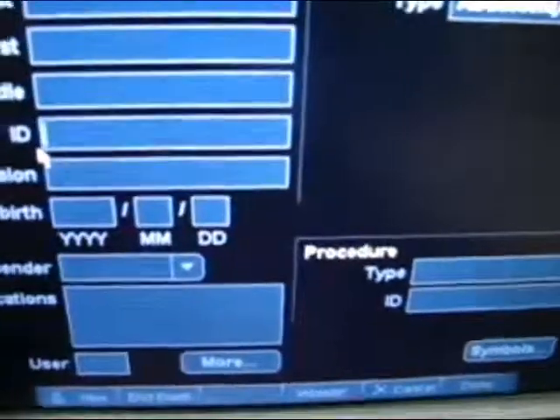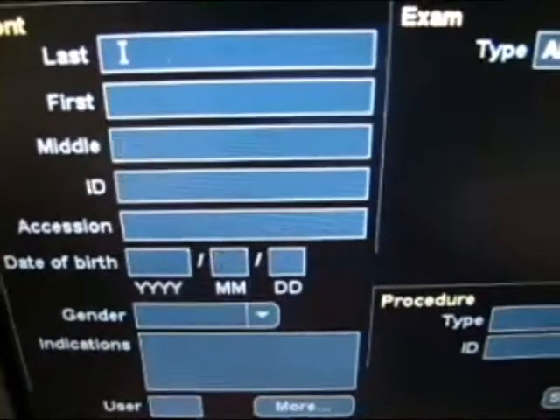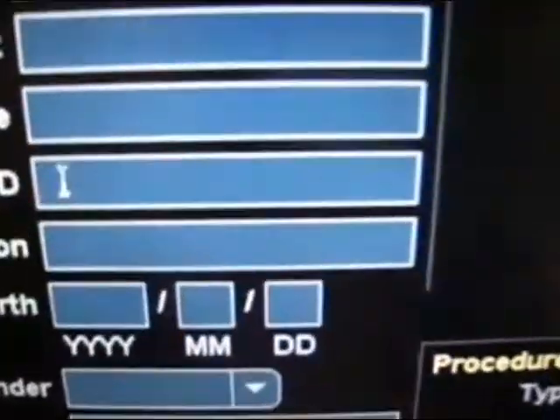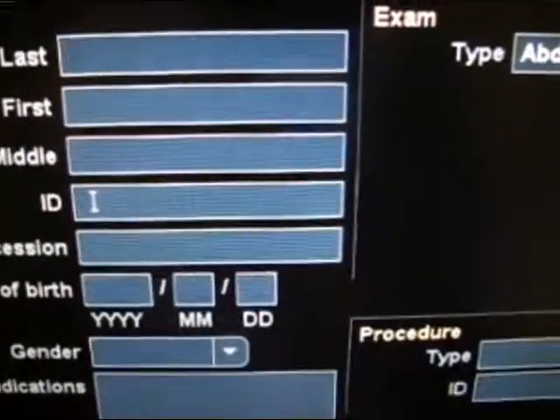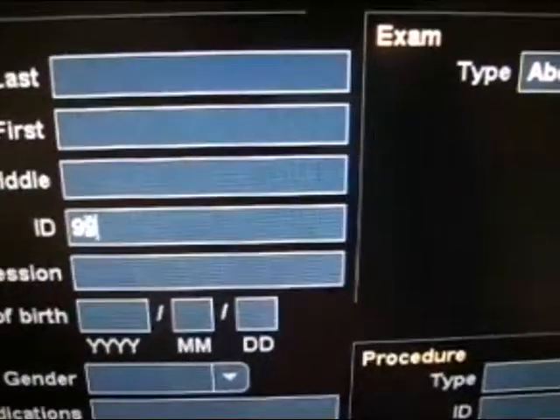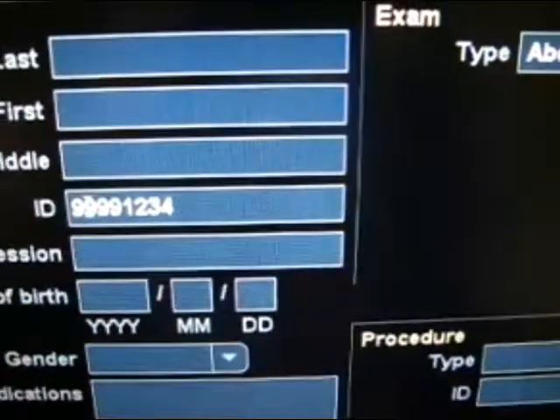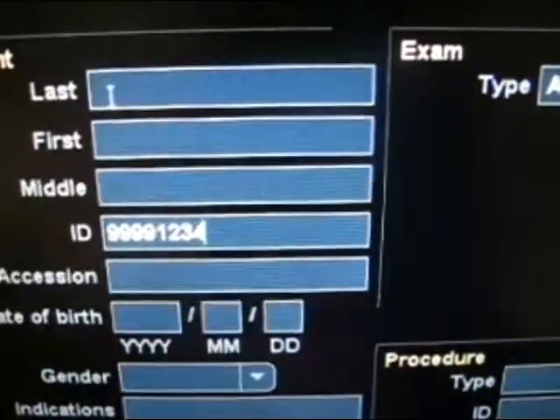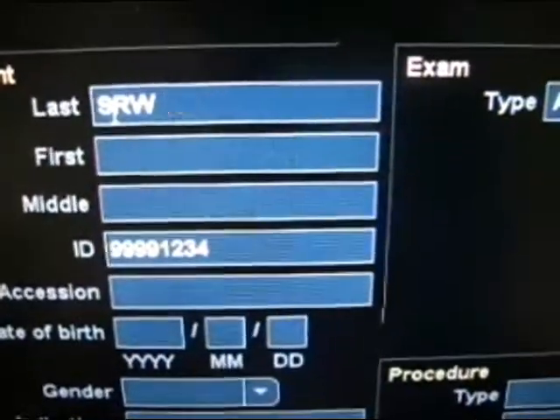Please remember to place your three-letter identifier in the last name slot, as well as the patient's medical record number in the ID slot. Please make sure that you include the entire eight-digit medical record number including the check digit — for example, 99991234. I would insert SRW as my three-letter identifier.